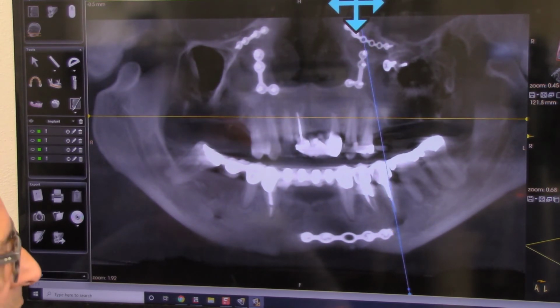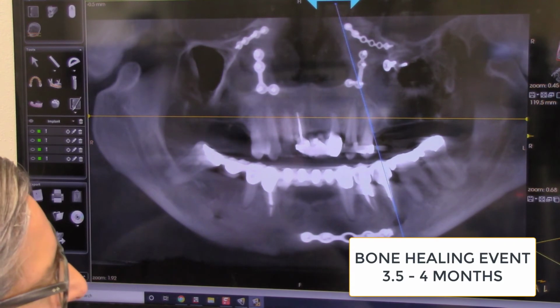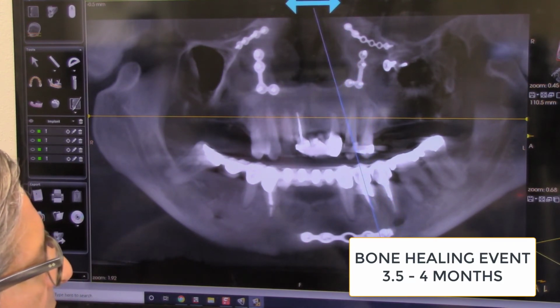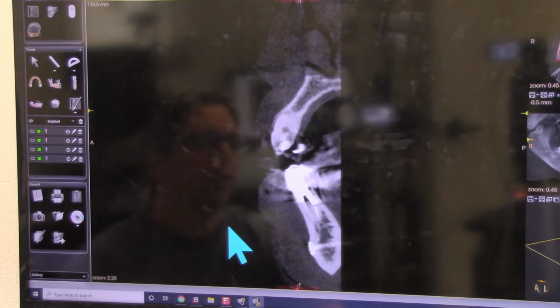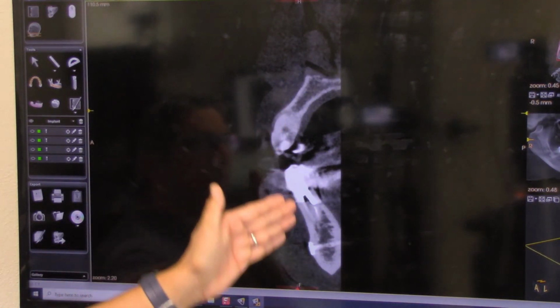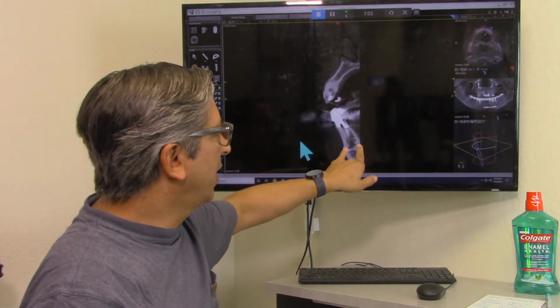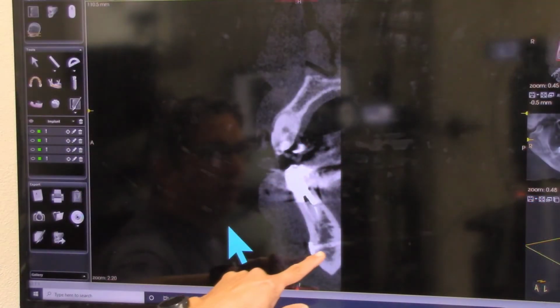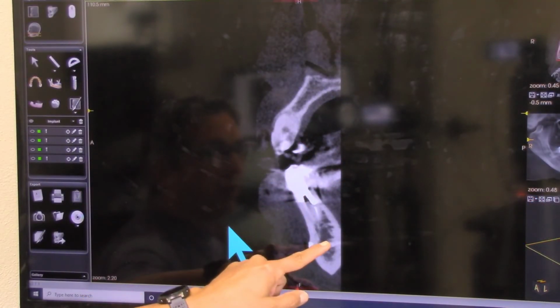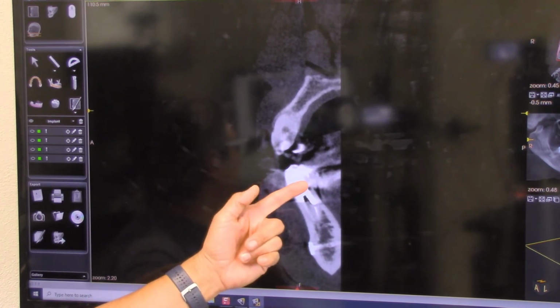I talk about projects like this in bone healing events. So here we have each of these teeth that become extracted, here's our constriction on the upper. Here's where it kind of has splotchy bone. We have a pin coming through here. We can't bring our implants that far, and we have to preserve the bone height as much as possible.